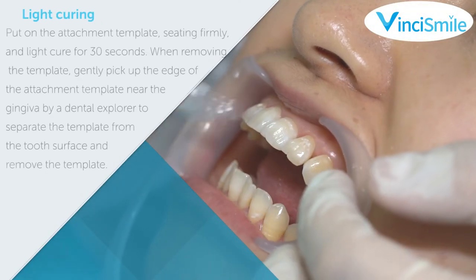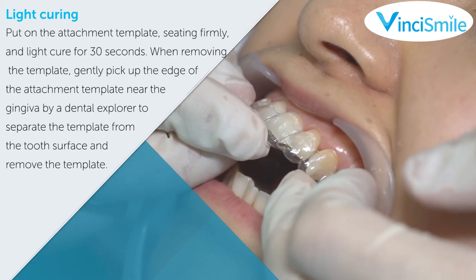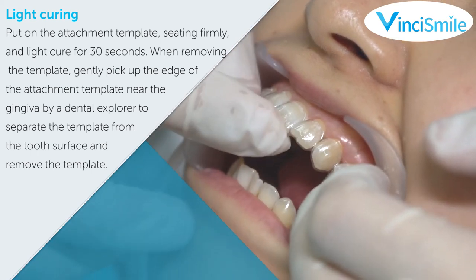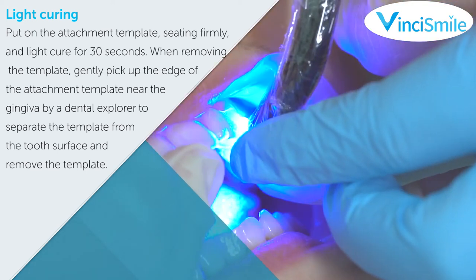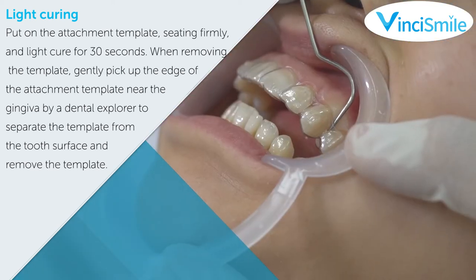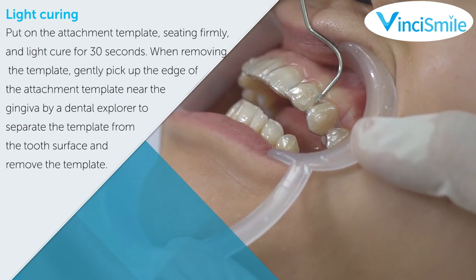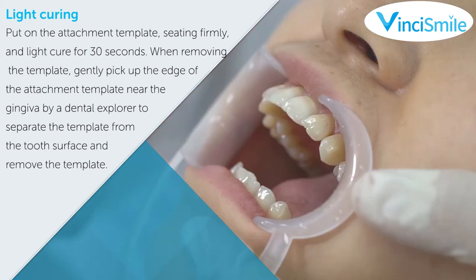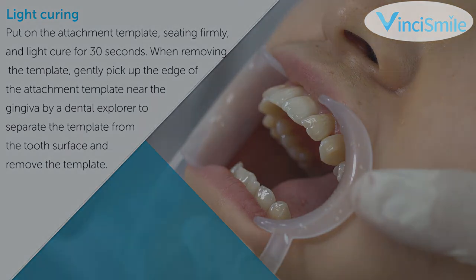Light curing: put on the attachment template sitting firmly and light cure for 30 seconds. When removing the template, gently pick up the edge of the attachment template near the gingiva using a dental explorer to separate the template from the tooth surface and remove the template.